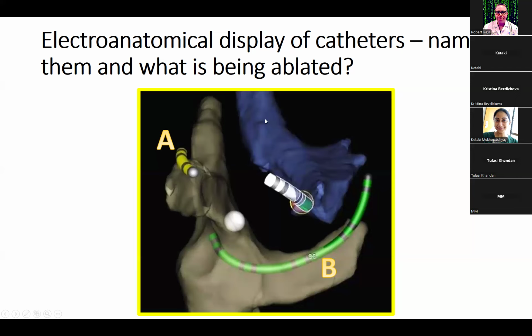But when they're over here, this is where we start having occasional failures. It's one of the more common reasons we have a failure in ablation. And this area over here can be sometimes a reason for failure because of difficulty getting the catheter to come around. And we have different kinds of sheaths. Barry will use the Agilis and just torque the sheath down this way. There's also something called an SL, or a Swartz left sheath, that actually makes a curve like this. It's literally a turning sheath, and then you push the catheter out and it comes out on this area.